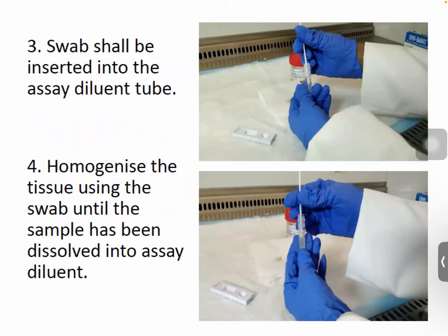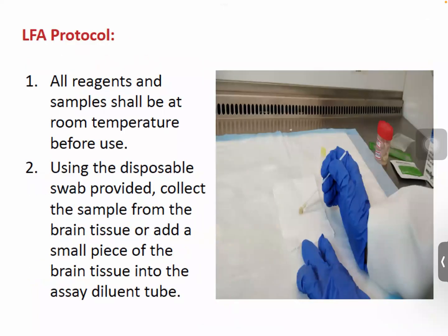But one thing that we experienced is when we did tuberculosis, we were working with sputum samples. Since the lateral flow is not that sensitive, if we use a lot of buffer, we cannot get the reading because the sample is too diluted. But if we choose not to use buffer, sputums have different viscosity. Some are not too viscous, some are too viscous, and then we have problems getting the reading because the sputum will not move to the end of the strips. So there are a lot of problems, and that depends on the type of samples.